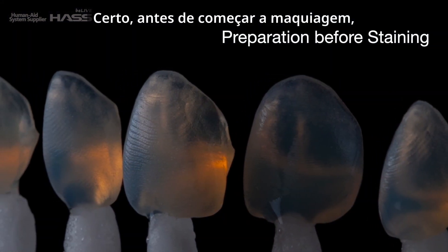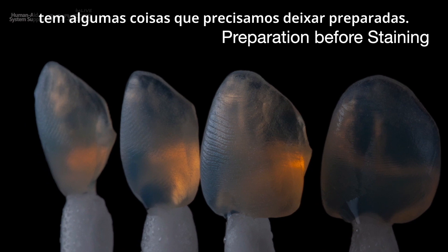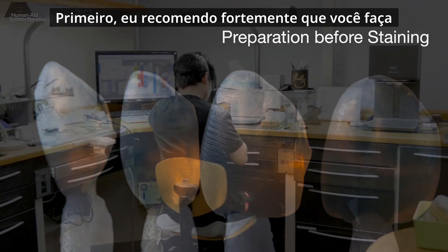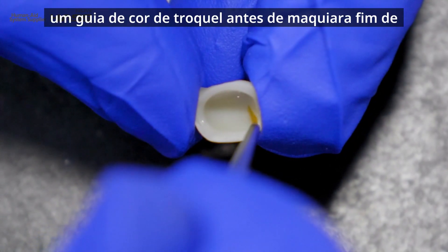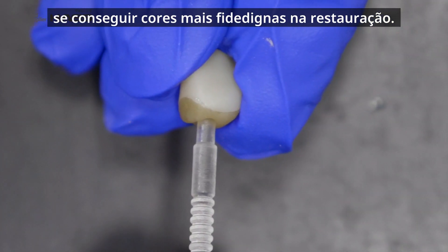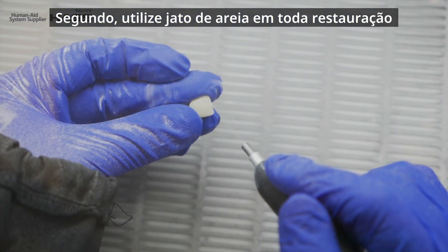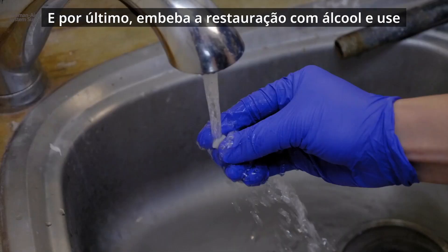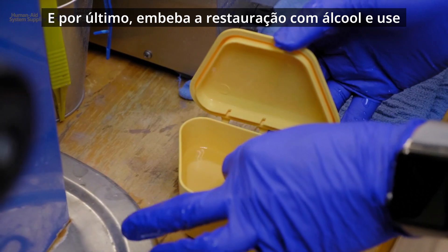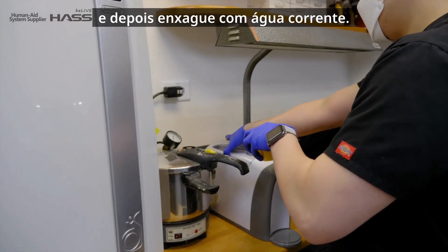Before we start staining, there are a couple of things we need to prepare. First, I strongly recommend making a stump shade dye before staining to achieve the proper shade of the restoration. Second, sandblast the entire restoration with aluminum oxide at about 10 psi or less. And lastly, soak the restoration with alcohol and use ultrasonic for about a minute, then rinse with running water.